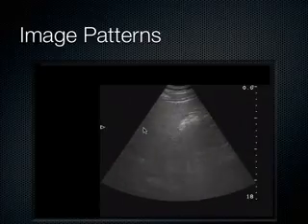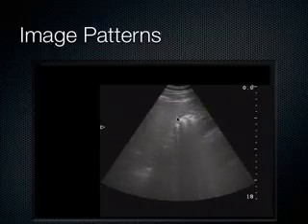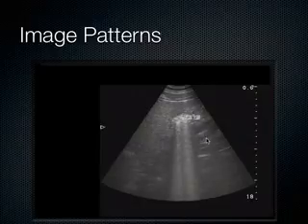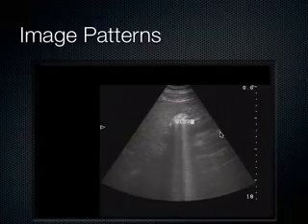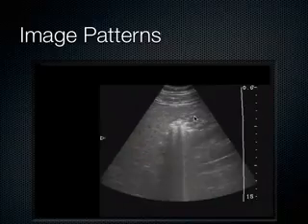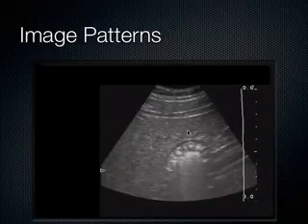This is all liver over here, okay? And we see this. How would you describe that? Is that a WES sign? The person that did this ultrasound is like, is this a WES? And that's why they're doing that. It's kind of funny, actually. But it's not a WES sign, is it? It's the duodenum.